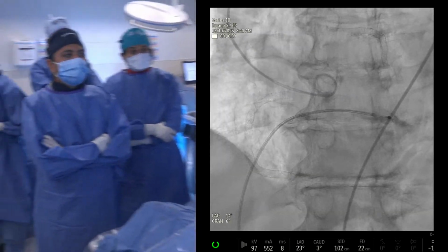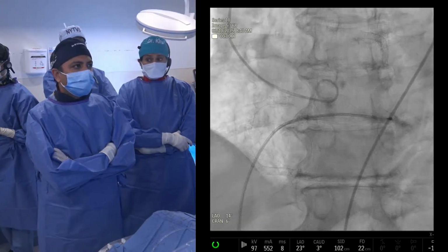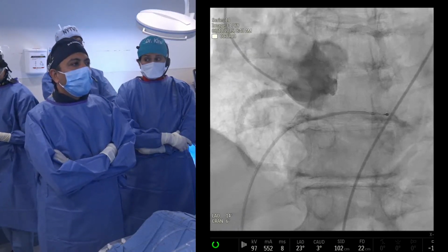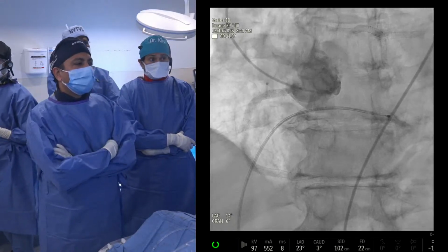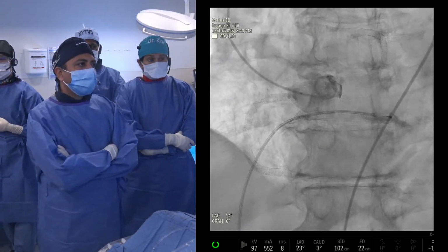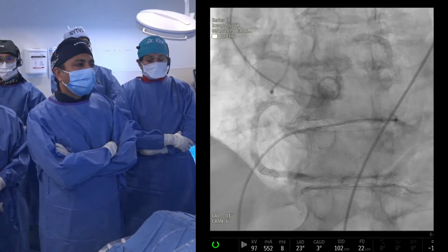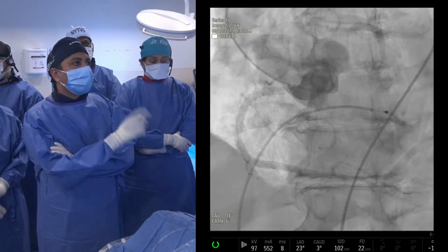If this patient was a little younger, although he is an 84 and robust patient, he has extensive CAD. If he was a little younger, my preference would have been a balloon expandable valve. And also, like Gilbert mentioned, the sinuses are roomy, and the coronary heights and the STJs are actually favorable for re-engagement. So if I'm doing a self-expanding valve, which probably would be the option for this patient in my preference, I'll make sure we do everything to get the commissural alignment.